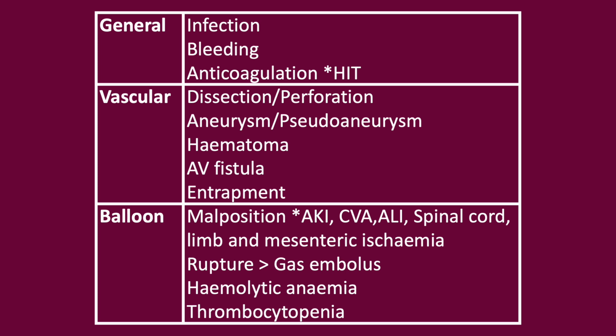The Benchmark registry reports an incidence of 2.6% for major complications, for example, limb ischemia or severe bleeding, and only 0.05% of in-hospital mortality was directly attributed to balloon pumps.